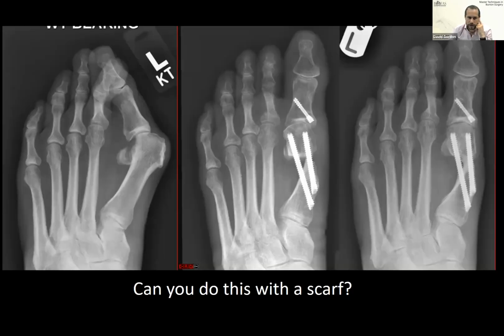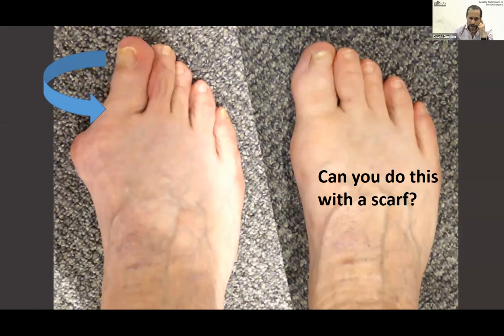So, can you do this with a scarf? Can you get these big translations? You probably can with experience with the scarf, absolutely. But I think in my view, most people may not be brave enough to shift this sort of degree with a scarf and have the same result. And I think really the rotation. If you look at the nail and how pronated it is, you can really derotate that metatarsal head back to anatomical correction.